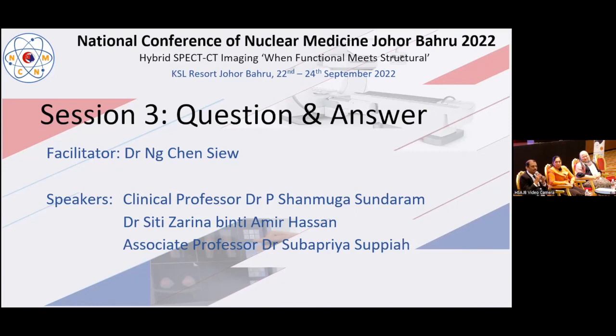Probably if you are having a platform, because the majority of the vendors right now are giving a platform for you to fuse the CTs also. So if we can do a CT separately, we can fuse and we can see. Probably only that much I can add for that technical advantage. Otherwise, it is really tough. I fully accept.